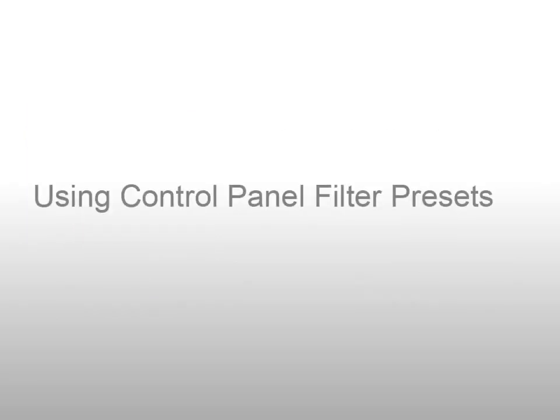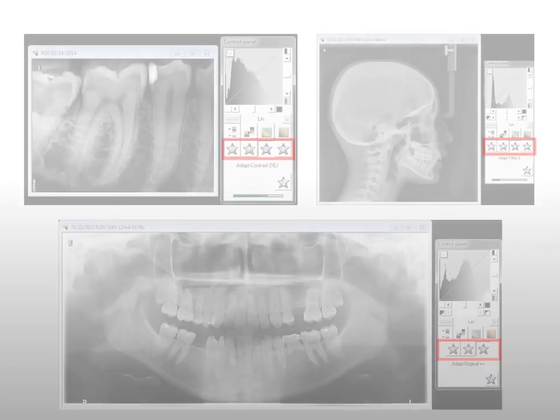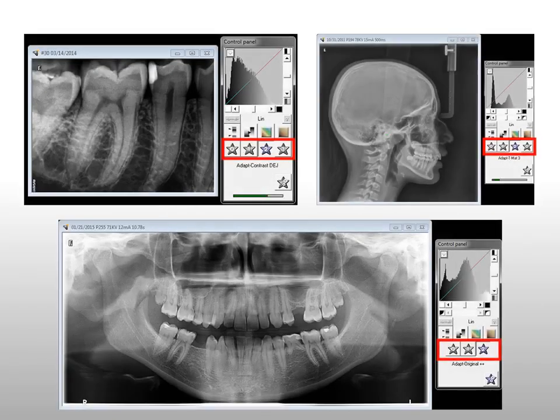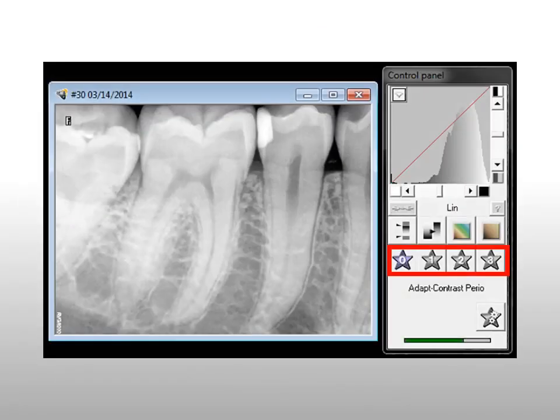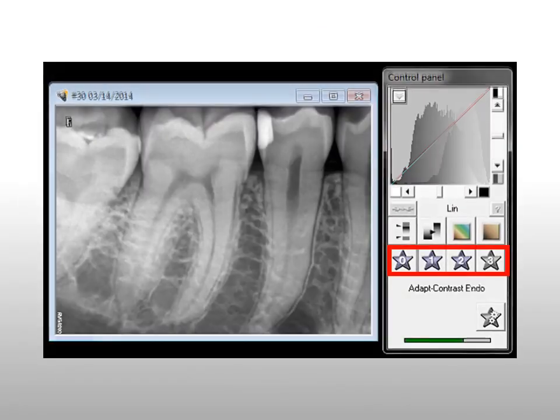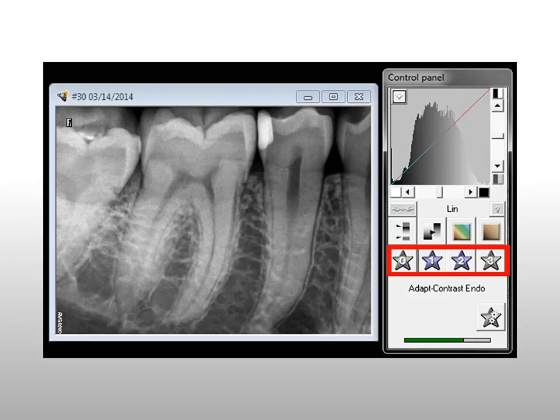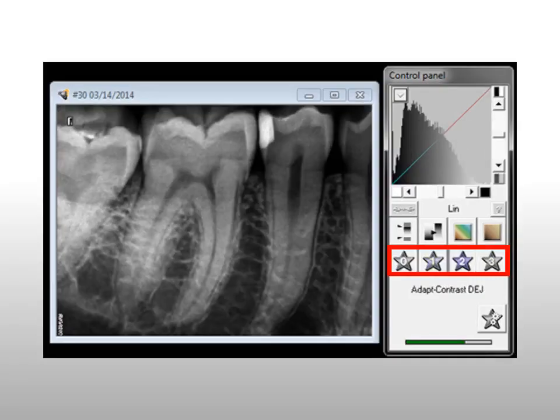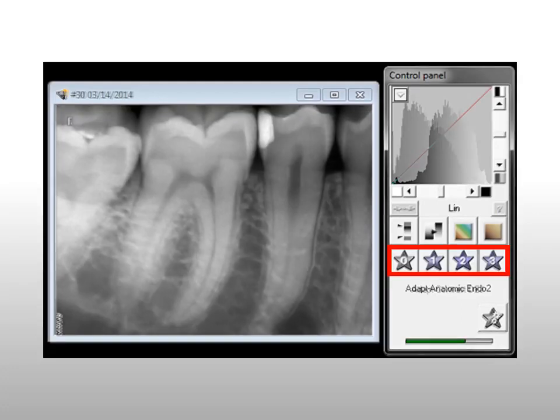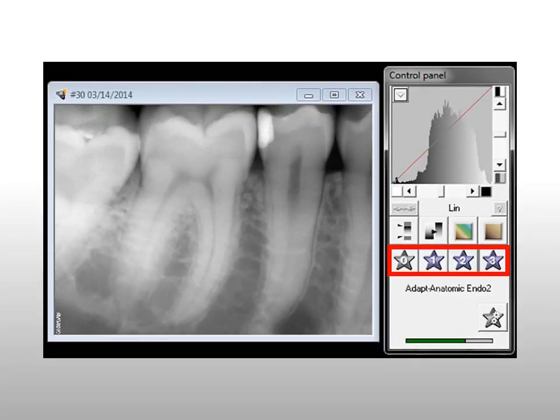Using the Control Panel Filter presets: When you open a radiographic image, a selection of filters offering various contrast enhancements is displayed in the image control panel. Select from these preset filters. The filters in the control panel are favorites configured among a range of filters. You can configure favorites by accessing the CS ADAPT library.